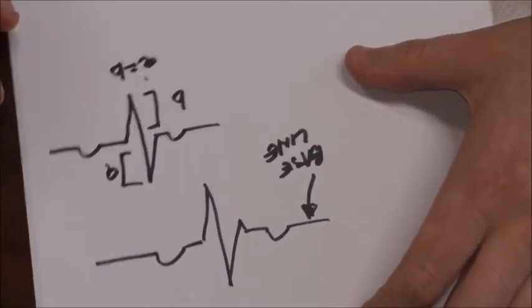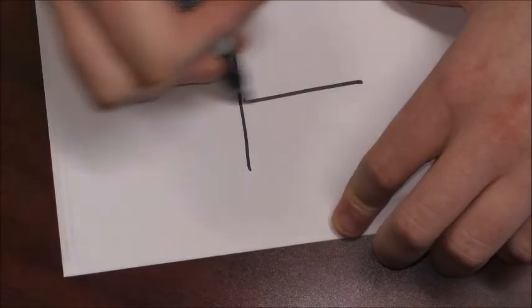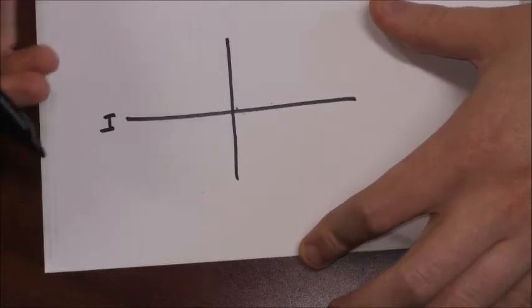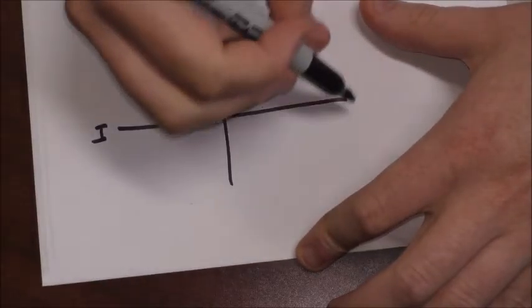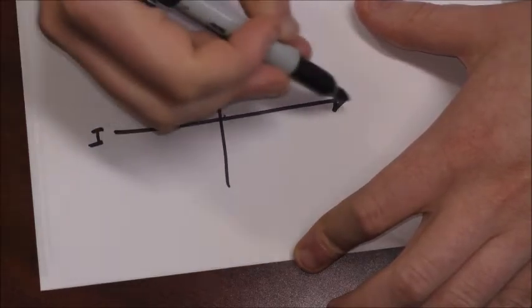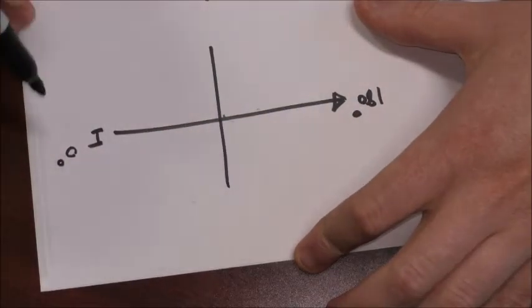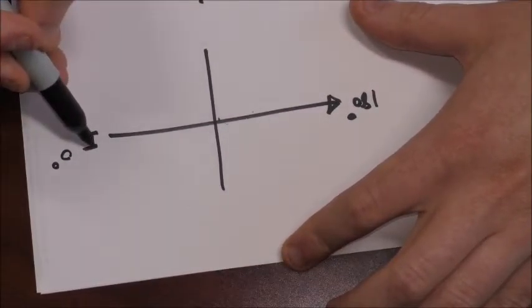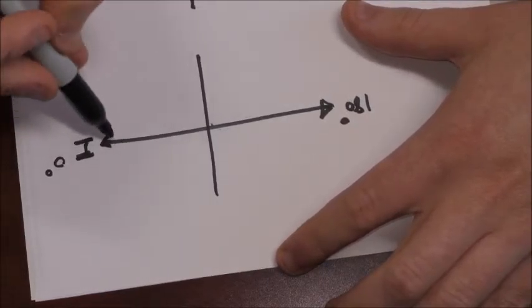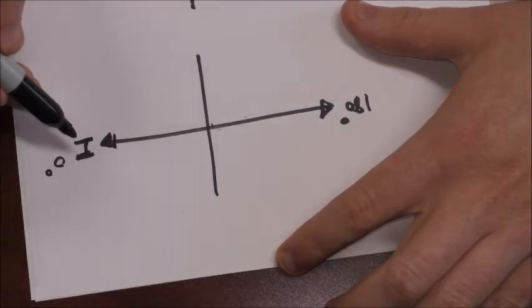So the way that this actually makes sense is going back to our graph. And I like to simplify it and just say if we look at, let's say, lead 1, and even though this isn't a lead per se, if this is 0 degrees, this would be 180 degrees. So anything that lead 1 is seeing, traveling towards it, the person standing over here would see the exact opposite of that.